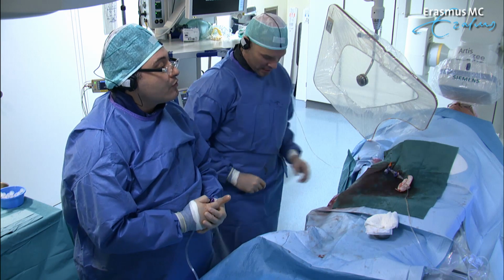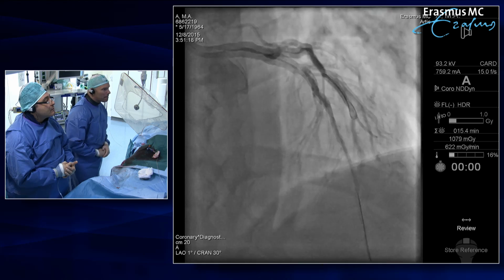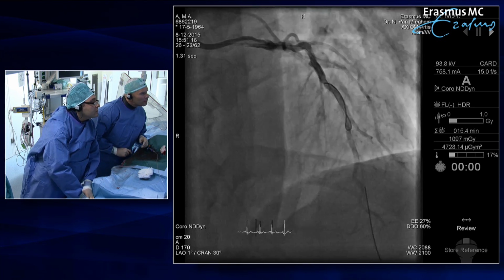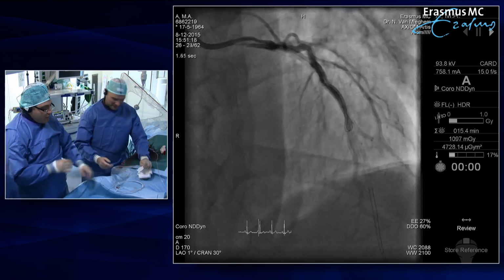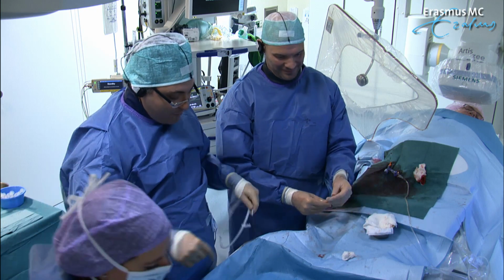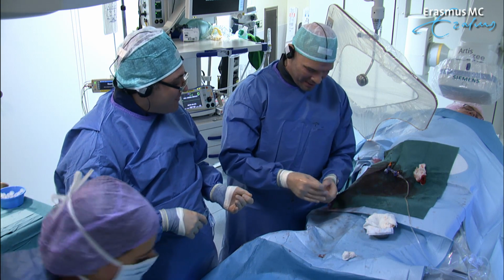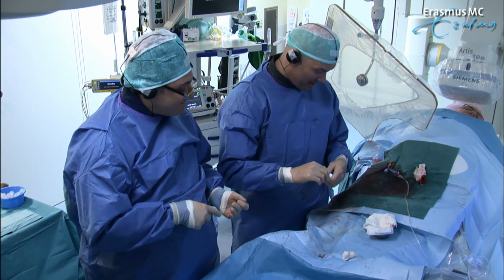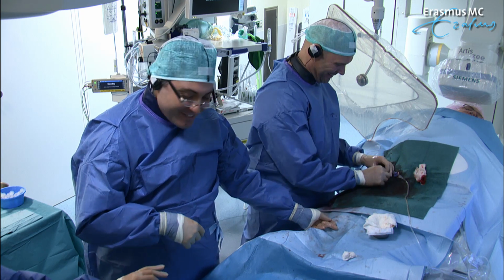Okay, are you ready for an angio? Sure. Let's go. Looks good, huh? So, do we dare to do another FFR? I think so. Let's go. Yes, we are doing multiple pullbacks today, so we are really stressing the technology. But we are not stressed ourselves because we can do it easily. Yeah, it is very straightforward. I prefer to stress the technology than to stress myself sometimes.